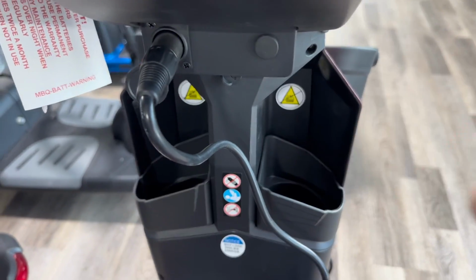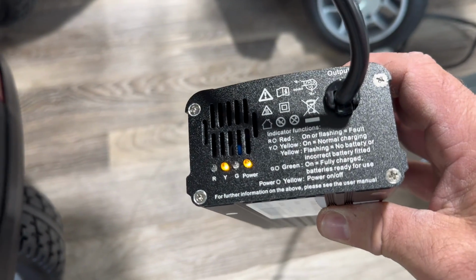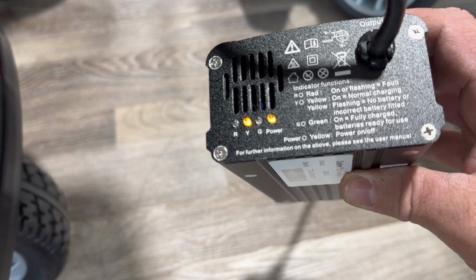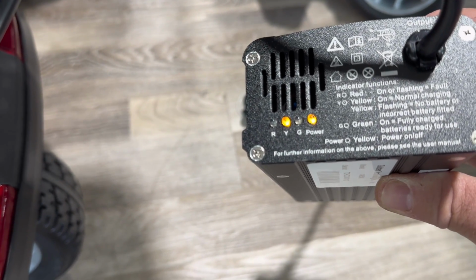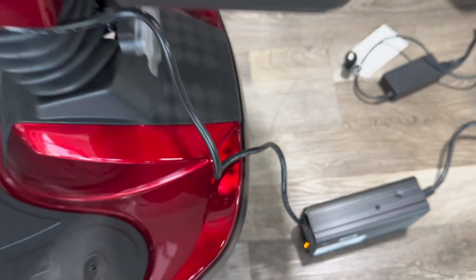So there's your charger port. I just fired up this charger. Even though it's at 100%, I like to give it a full charge. Here's your supercharger. And that light should turn to green when it's fully charged, the light where it says G, I think. It's the first time I've seen this charger.